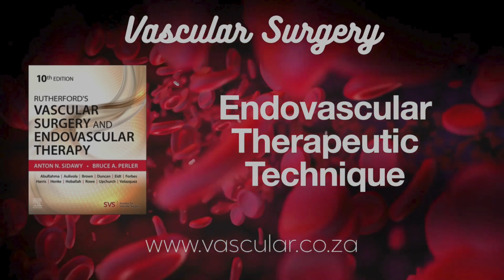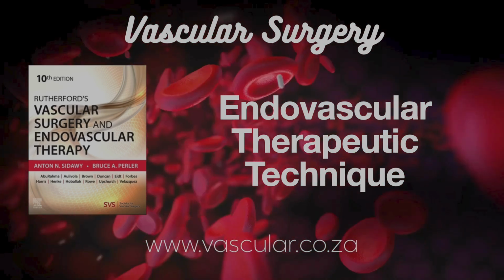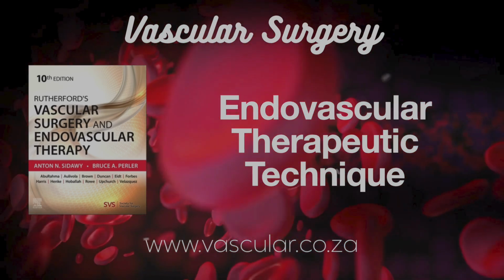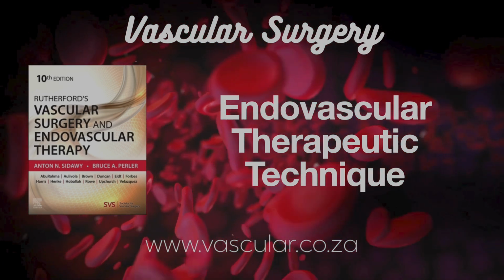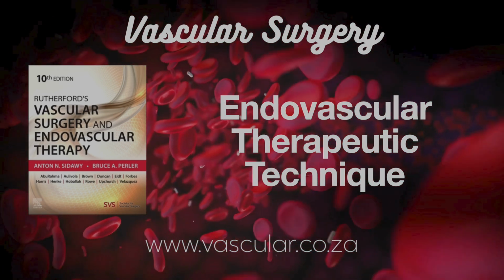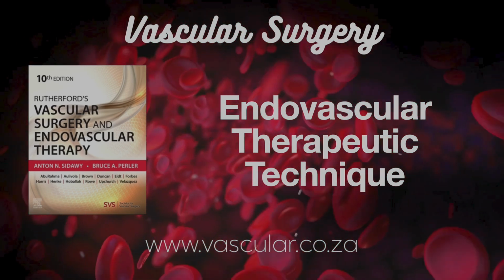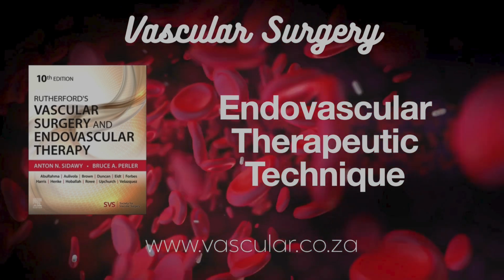Clever. Has it worked in practice? It got European approval back in 2009. Early studies, like an Italian multi-center trial, have shown good results. Decent one-year patency of the main artery, very high side branch patency, aneurysm thrombosis in most cases, and no reported ruptures. It's also being looked at for complex aortic dissections and supplementing standard EVAR, a really different approach to aneurysms.